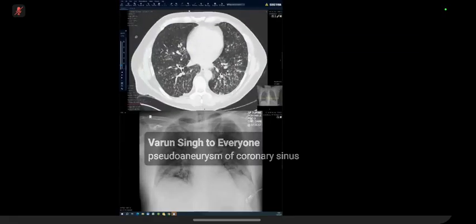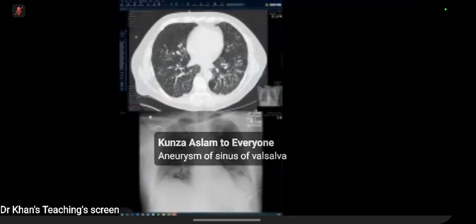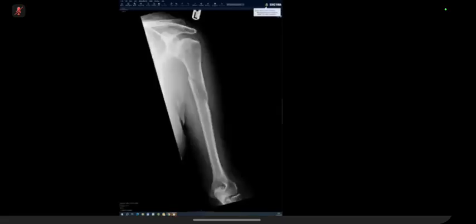Okay. And is that a reportable disease in terms of infection? Do you need to highlight that? Yeah. I will immediately communicate these findings to the referring clinician, as the patient needs to be isolated till the anti-tubercular treatment is started, as the patient will be communicable in the interim. Okay, perfect. Let's do one last one.